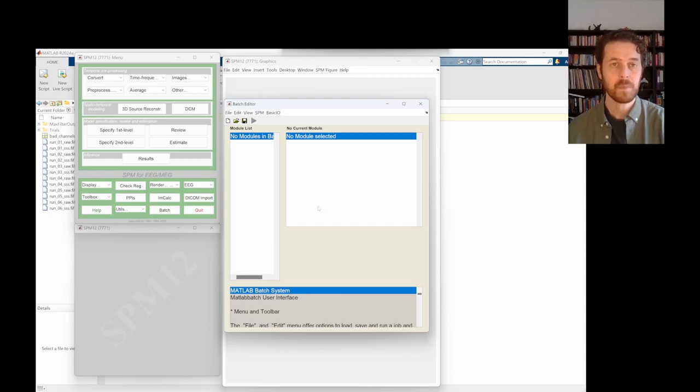So you'll often be provided with some kind of brief summary information about the process and what some of the settings do. We have a ribbon here in which we can start a new batch, load up a previously saved batch, or save the current batch. And right now we have a grayed out play button. The play button will always be grayed out whenever the current pipeline isn't ready to run. That's typically due to there being a missing piece of information.